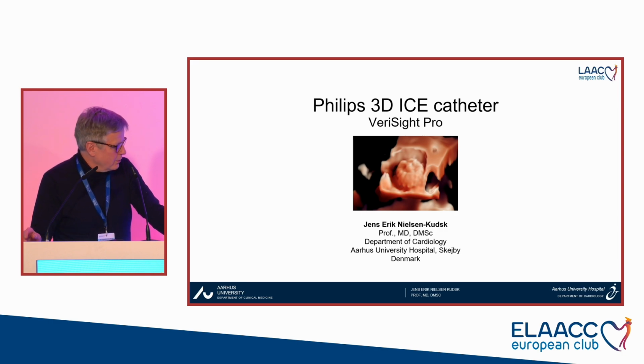Any further questions? I mean, it's a super interesting new concept. So it's also my pleasure to talk a little bit about the future of a 3D ICE catheter. And I will say that this technology has been underway for many years now. Actually, it is more than 5 years ago.